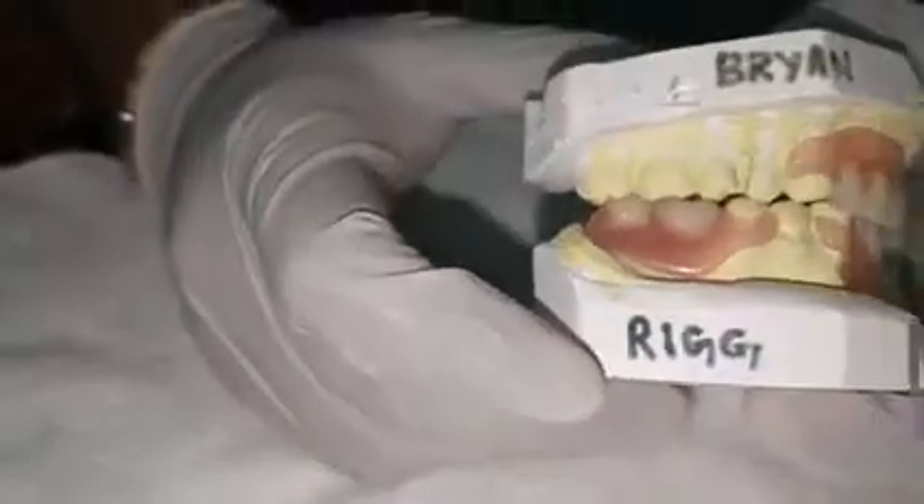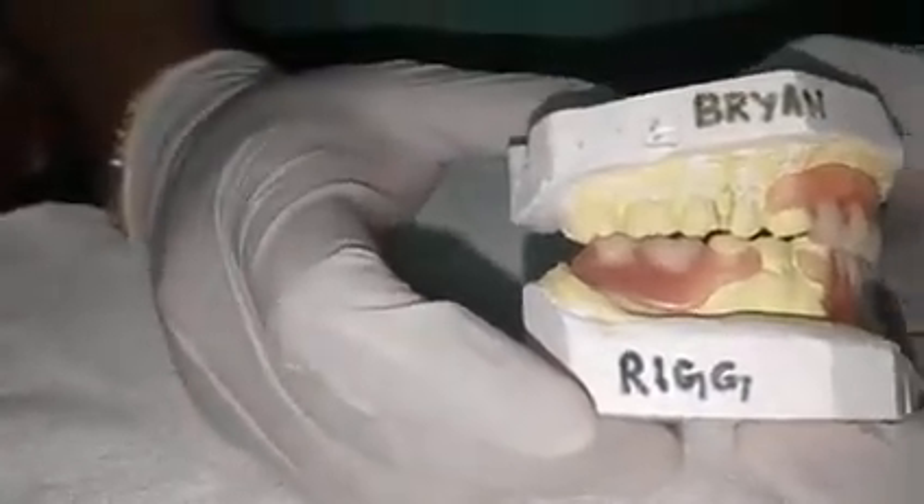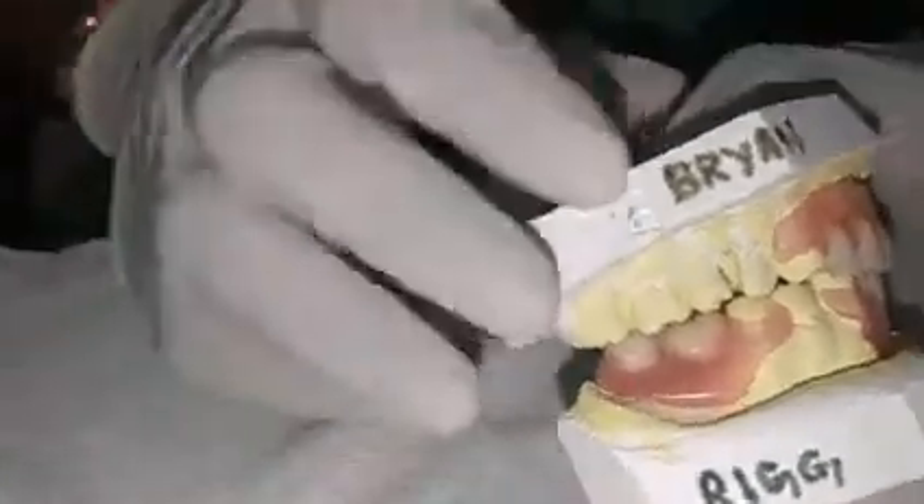Hello friends, today I have made flexible dentures for my patient. These are upper and lower flexible dentures I have made for them. This is the upper one.